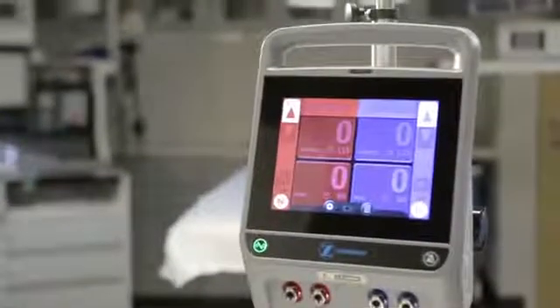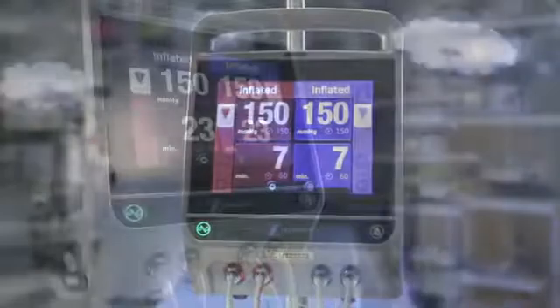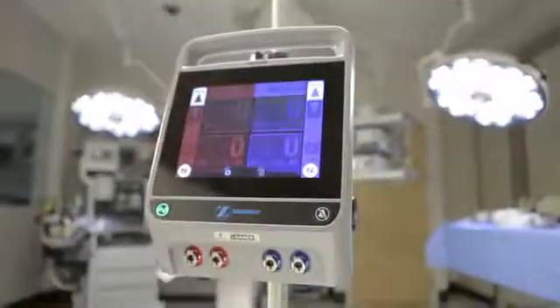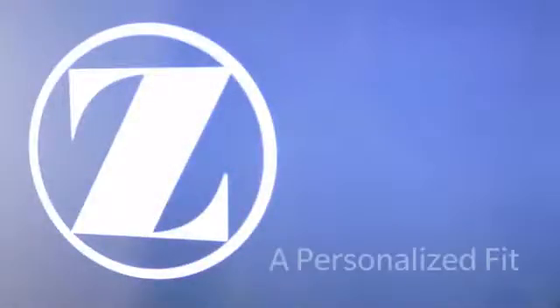With a large and intuitive touchscreen interface and powerful personalized pressure technology, the ATS 4000 tourniquet system from Zimmer Biomet is not only a leader in its field, but offers a way to truly differentiate and personalize the patient experience. A personal focus, a personalized fit. ATS 4000 from Zimmer Biomet.